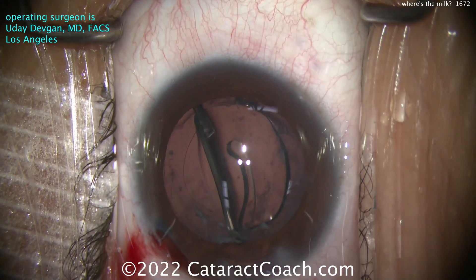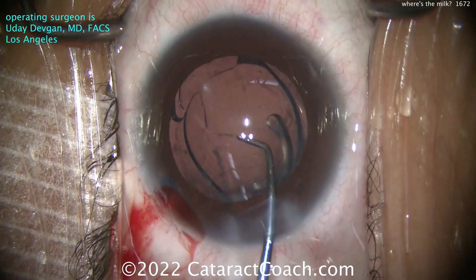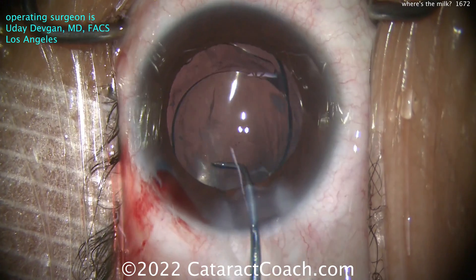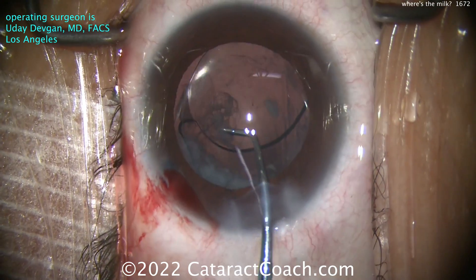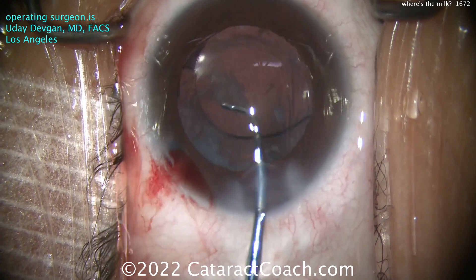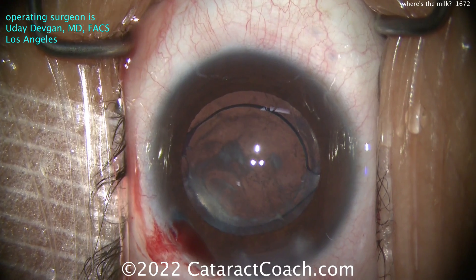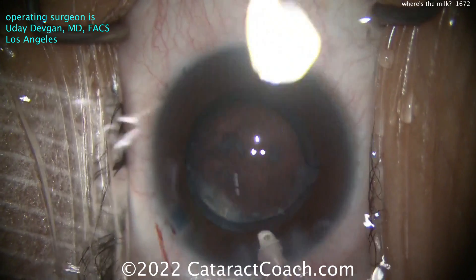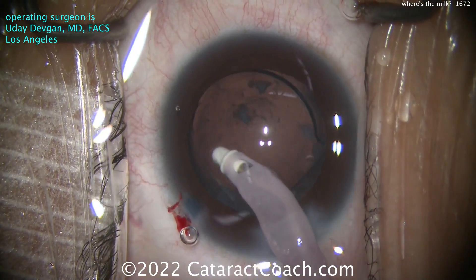We have our incision on the patient's steep axis of astigmatism, which is helpful. That's also why we have a slightly bigger incision - a 2.75 incision in this case instead of a 2.2. There's the lens, now we'll get the haptics opened up. You can see just about a five millimeter rhexis - that looks pretty good. I'm really trying to loosen up with that haptic - see how the haptic sub-incision is catching some of that cortex and loosening it, intentionally, so I can aspirate it. Now I've placed the haptics at 12 and 9 so that the optic can come closer to the sub-incisional space.